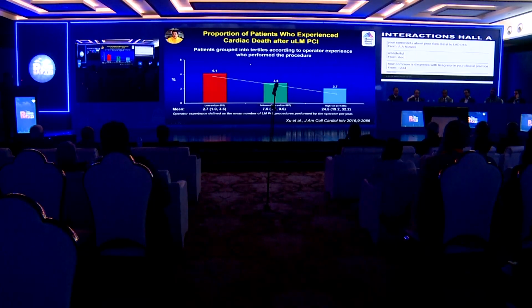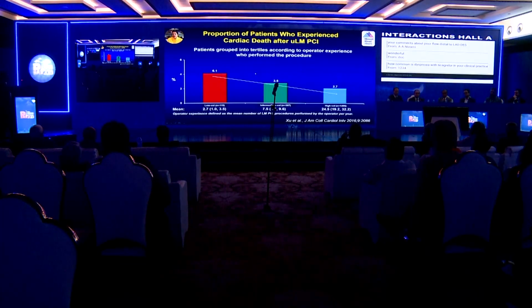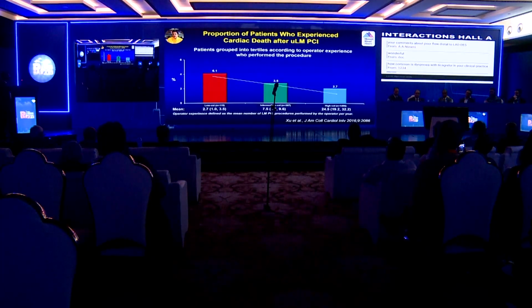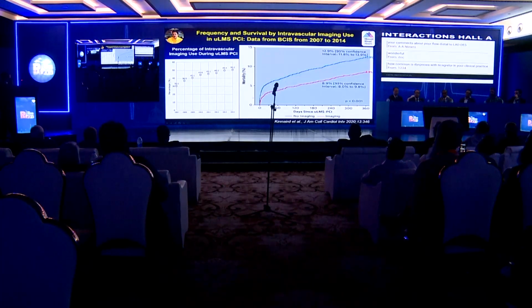And if you see here in this paper, the patients who experienced cardiac death in unprotected left main PCI were grouped into tertiles according to operator experience. So very, very important. Who were these people? High-volume operators, those who did more than 24 cases per year, did a better job. The low-volume operators actually had a poor outcome. So it is very important to consider who should be doing this kind of complex procedure in this day and age.